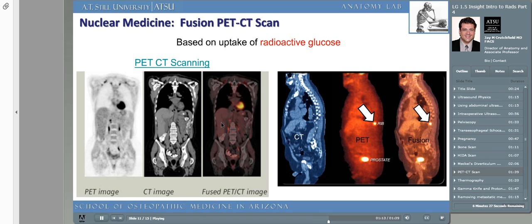However, if the patient is given such a huge load of radioactive glucose, the body, of course, during the scanning time, won't be able to use all of that glucose, and by default, it has to be excreted somehow. Be careful interpreting this as diabetes because it could just be a normal finding of the massive glucose load the patient was given to try to find any metastatic lesions.